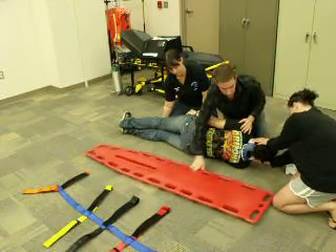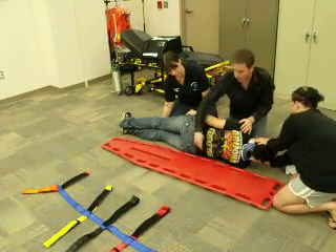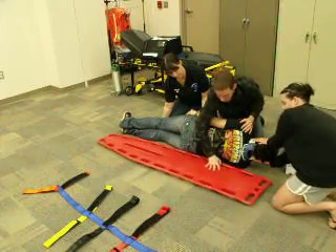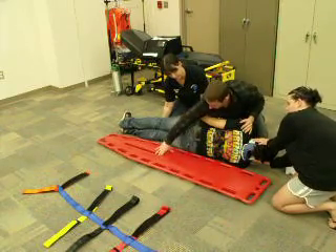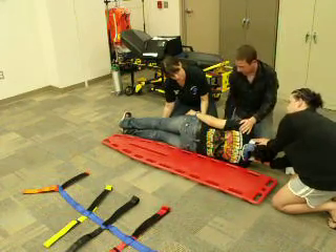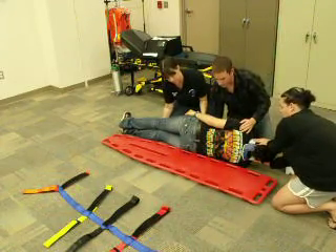I'll assess the padding at this point in time and pad any voids that need to be addressed. Let's go ahead and log roll the patient back — down on three: one, two, three.